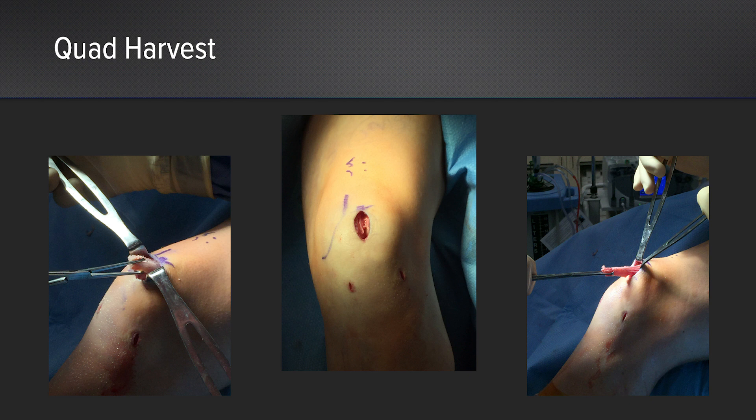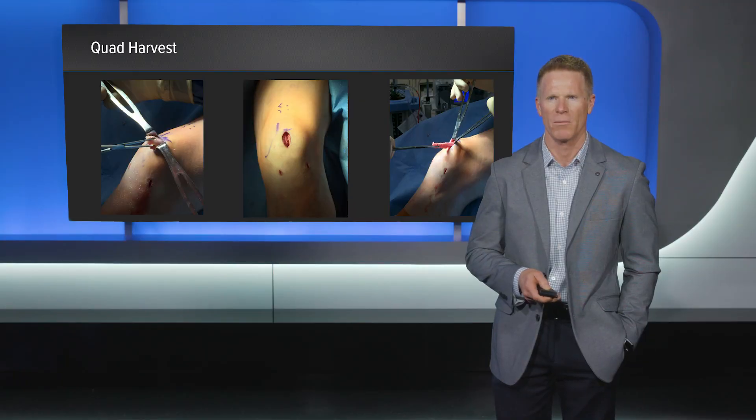We then turn our attention to the quad harvest. A 2 centimeter incision was made at the superior pole of the patella. The dissection was carried down through the peritenon, which was swept medially, laterally, and proximally. Then a 10 millimeter double blade knife was used to harvest a central slip of the quadriceps tendon to a distance of 65 millimeters.